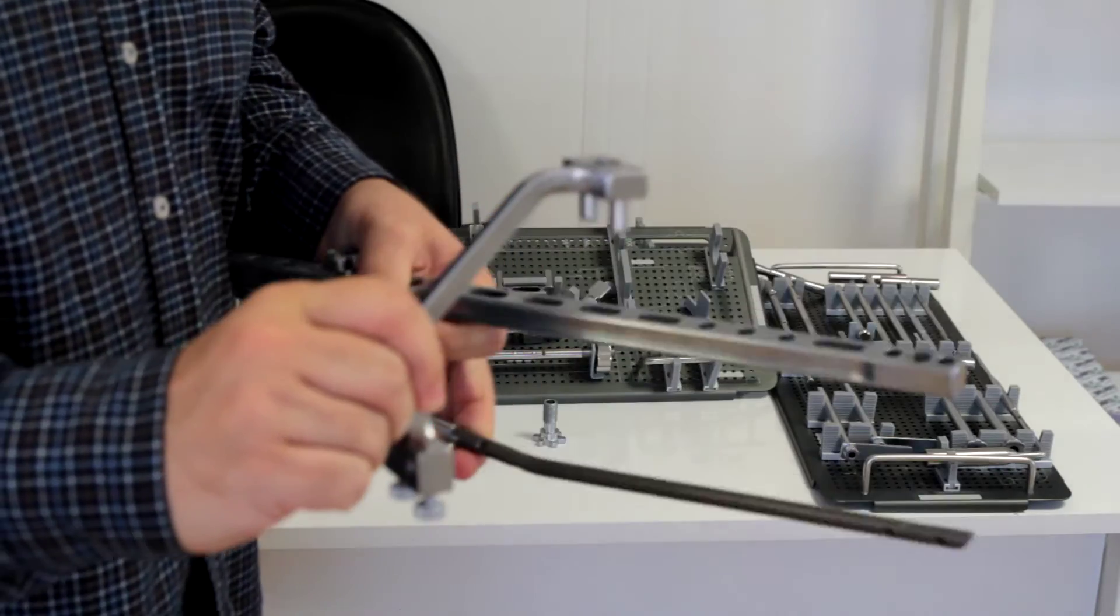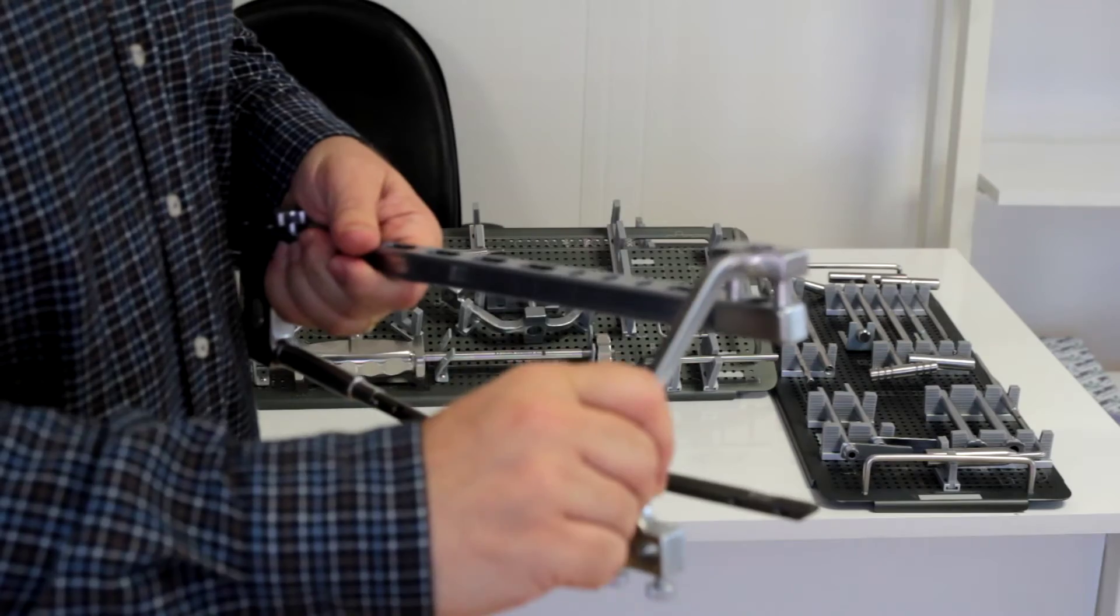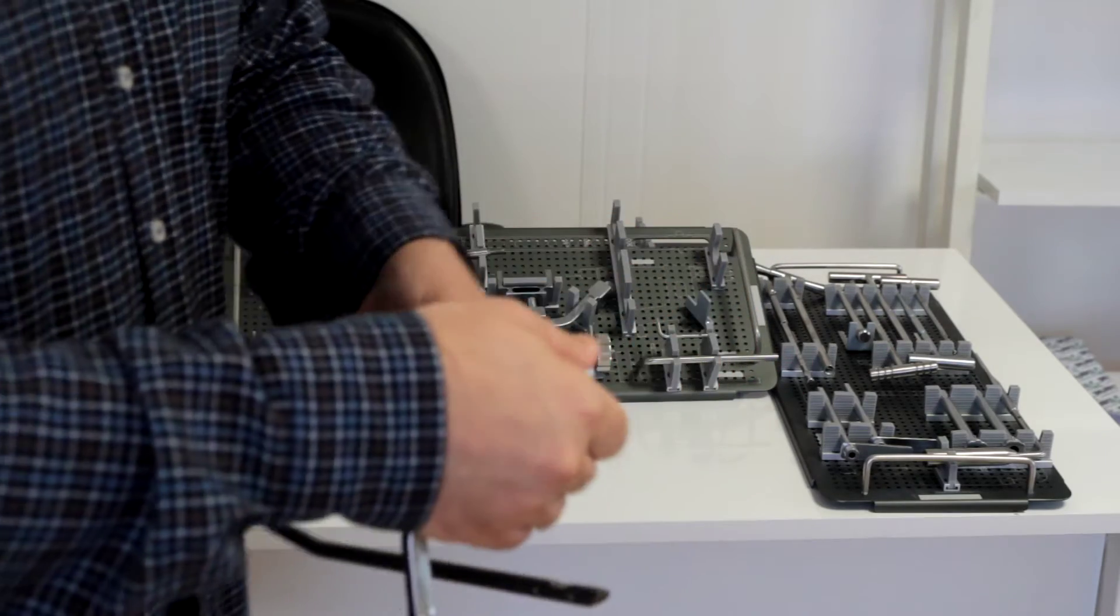Then you should use this part in order to make distal locking.